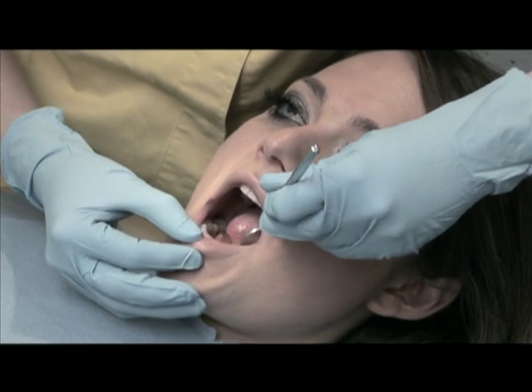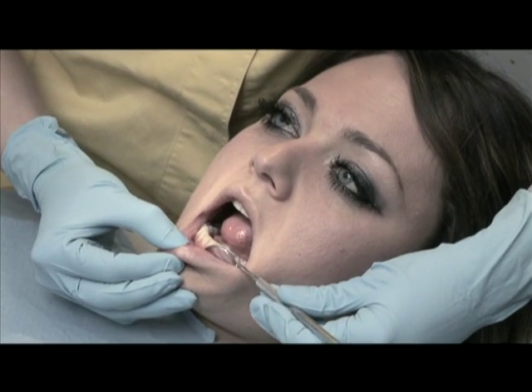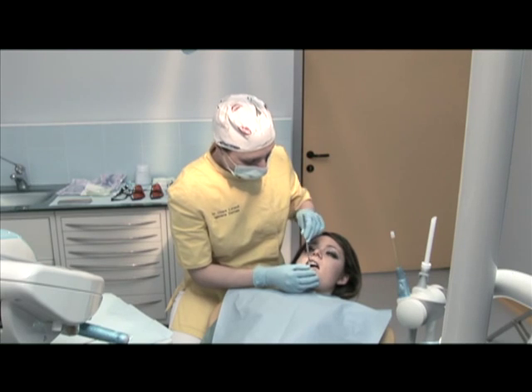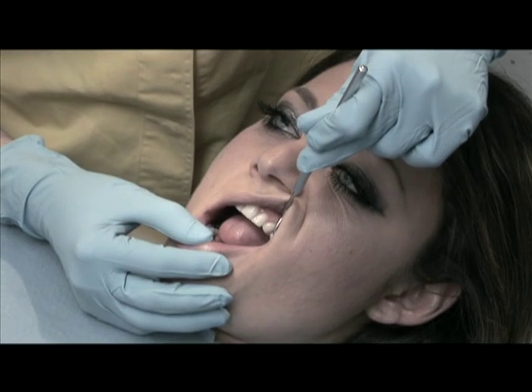Before beginning the treatment, make a quick check of the teeth and soft tissue to determine if there are any restorations that may affect the whitening treatment results.